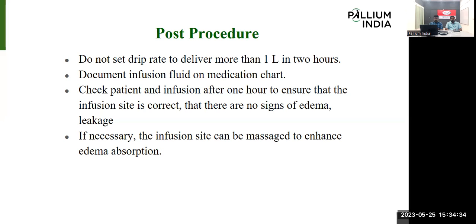As I already told, mild edema is normal only. If the edema is not subsiding, we can give a mild, gentle massage on that area to help it subside. Again, if it is not subsiding and is increasing, we need to change the site.